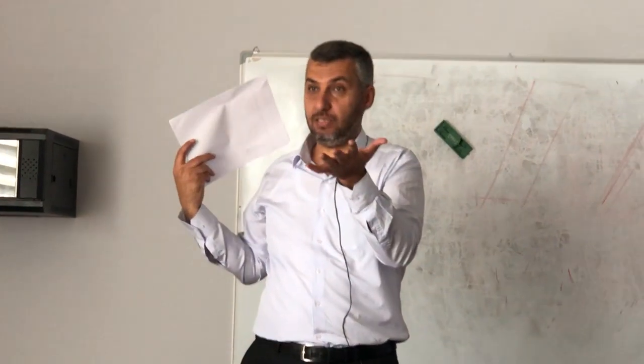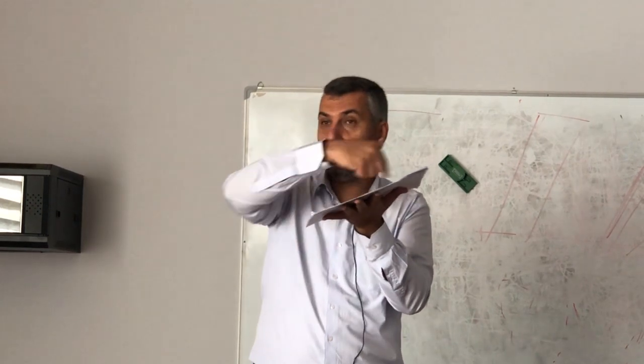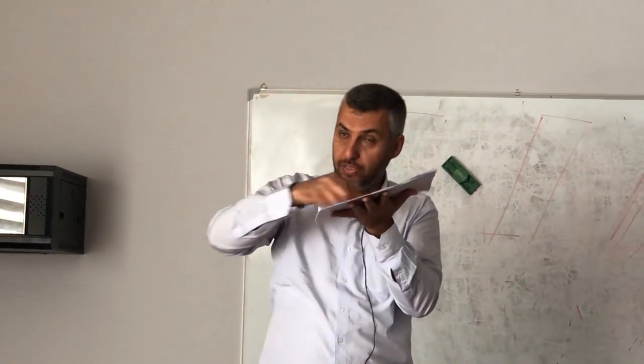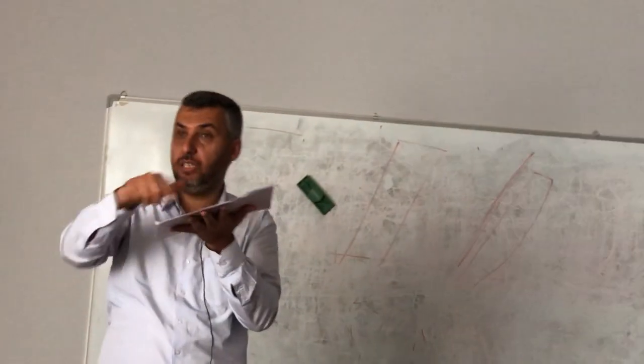I want to remove the cast. Sorry for that. This is the chosen tilt. I will do the marker, the survey line. Now I finish my survey line. After that I will do tripoding.